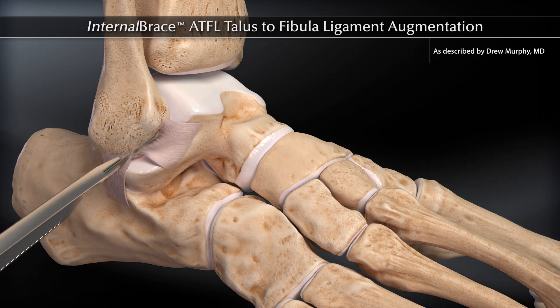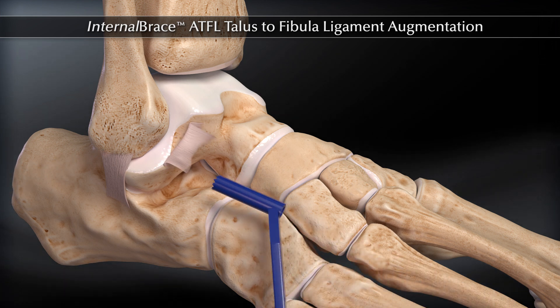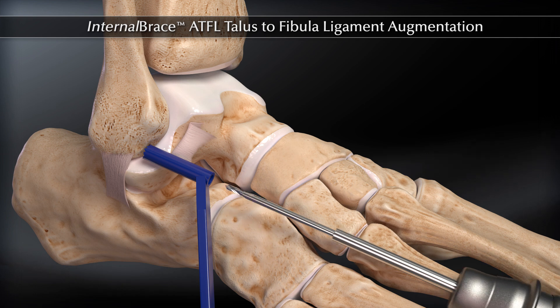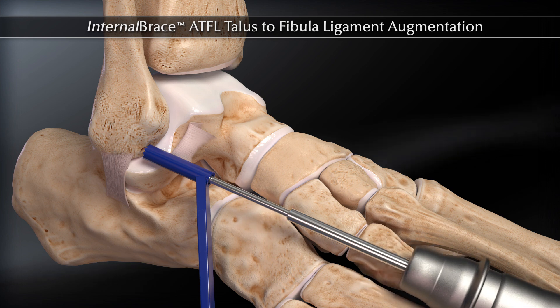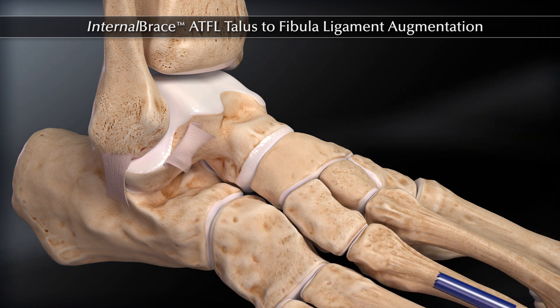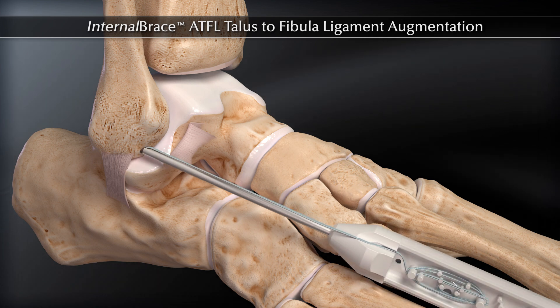Cut the ATFL and capsule away from the fibula. Drill and implant two 2.4 mm or 3 mm small joint or mini-suture tacks for the Broström, approximately 1 cm and 2 cm above the tip of the fibula, both on the anterior surface.